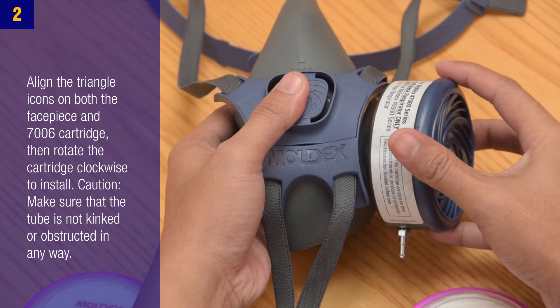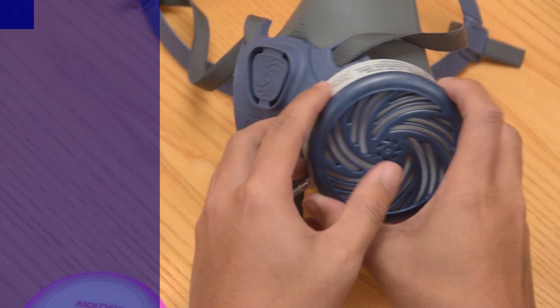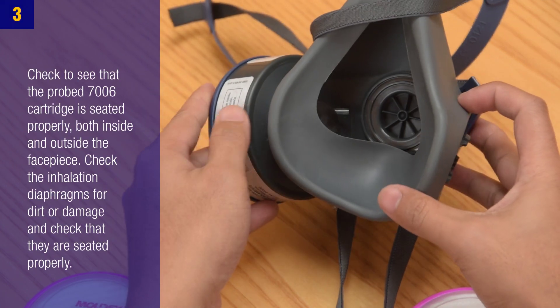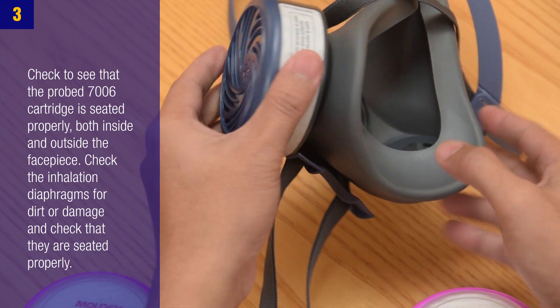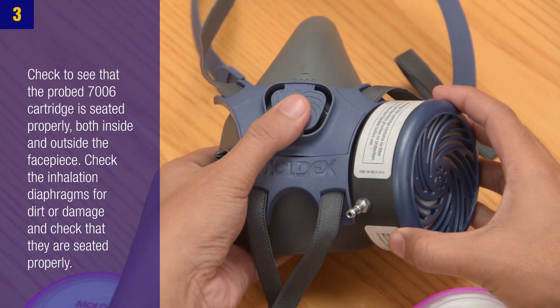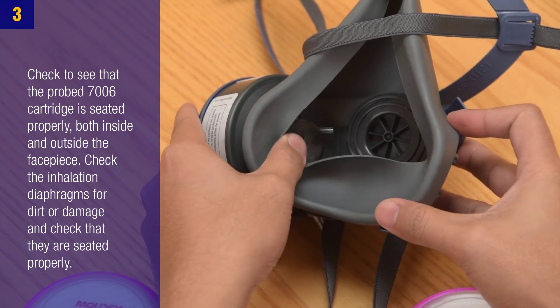Caution: Make sure that the tube is not kinked or obstructed in any way. Step 3: Check to see that the probed 7006 cartridge is seated properly both inside and outside the face piece. Check the inhalation diaphragms for dirt or damage and check that they are seated properly.